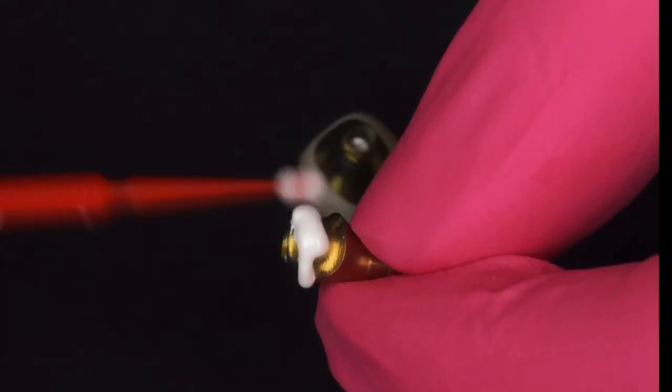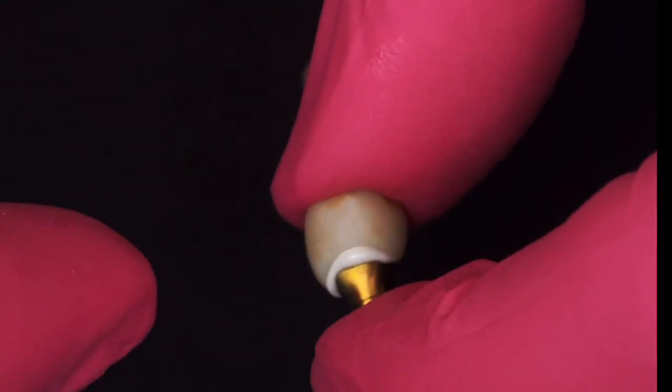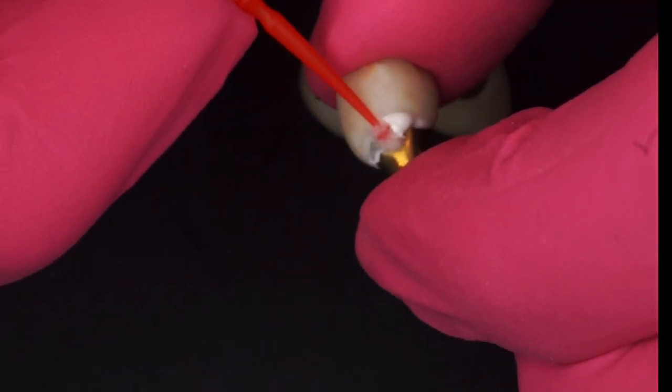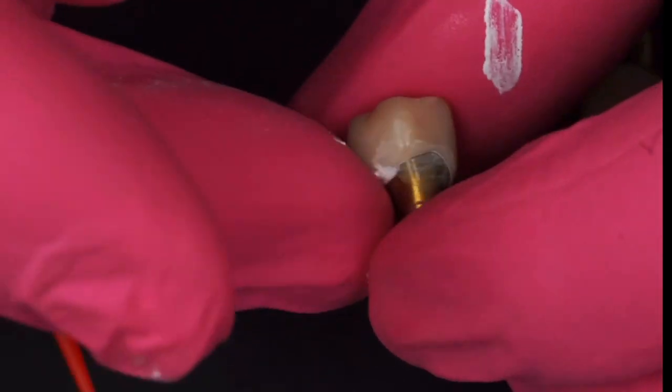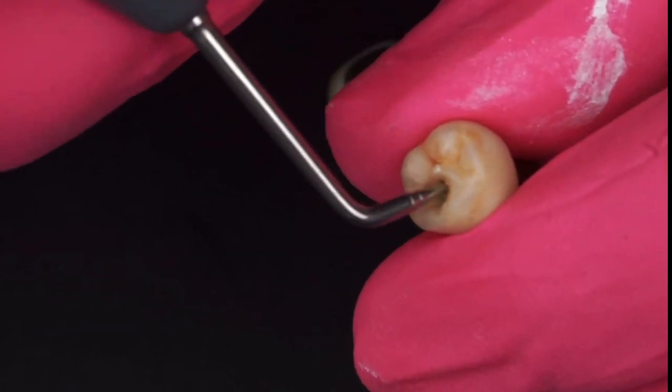So now we're going to actually coat the titanium here with the Ivoclar abutment cement. This is auto cure only. It is not light cured at all. I thin it out with a micro brush and then I press down really hard and squeeze that restoration. You want to do that for five full entire minutes. I violate the instructions for use here and wipe away the excess cement. You're supposed to just let it set up, but the reason why I have issues with that specifically for gold anodized abutments is to remove it you typically will scratch or damage your gold anodization of the abutment on that subcritical contour and that bothers me so I don't like doing that.